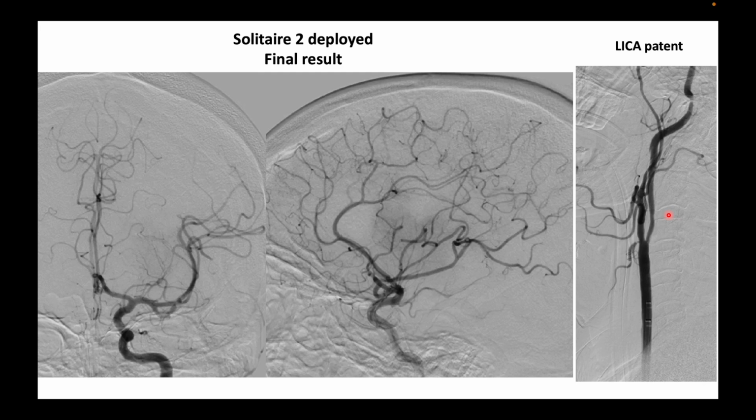But if this was not holding well, then we don't have a choice. We will stent this carotid during the stroke intervention. We will give the patient half the coronary bolus dose of Aggrastat because there is no dual antiplatelet on board at present. And once the procedure finishes, we will put an NG tube into the patient and give the patient dual antiplatelet loading on the table. Now we mostly do it with ticagrelor 180 milligrams and Disprin 300 milligrams. So that's a risk you have to take even during stroke intervention.